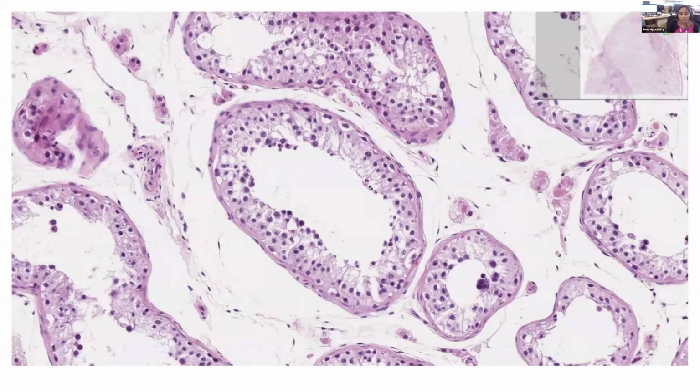The background was very tricky. I struggled to work out which stage we have reached in spermatogenesis. I couldn't find spermatozoa. It could probably be spermatid level, and all these bigger ones, I think, are probably vacuolated spermatogonia rather than any GCNIS in the background. And because of the meiotic-type chromosomes, probably these are the spermatocytes. So I don't know whether something's going on. He's a 38-year-old man, so probably we should know something about the background testis in this case. It might be important for him.